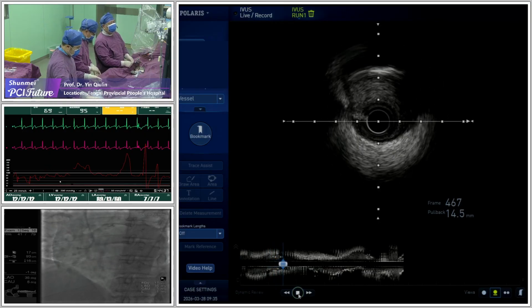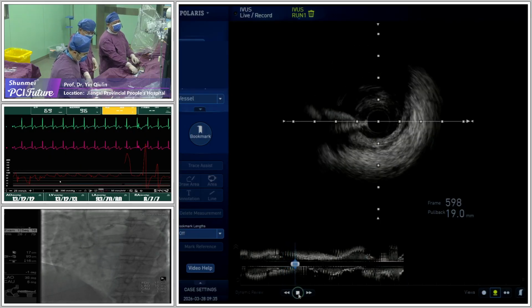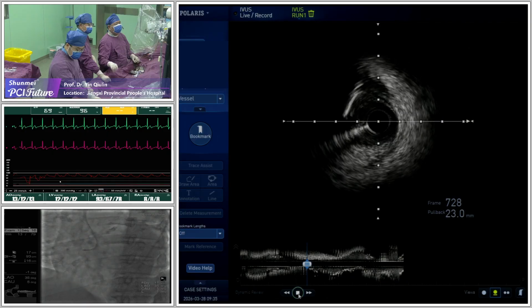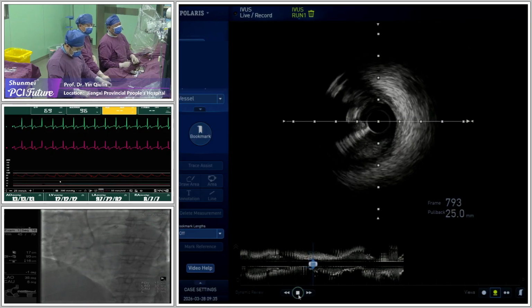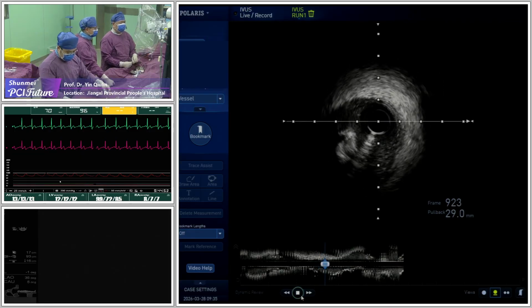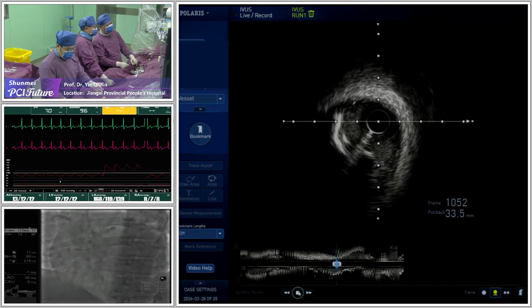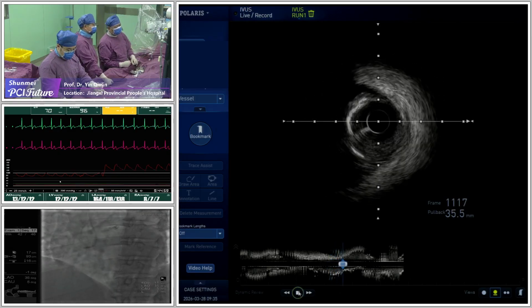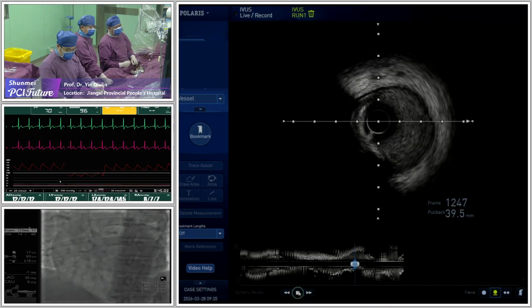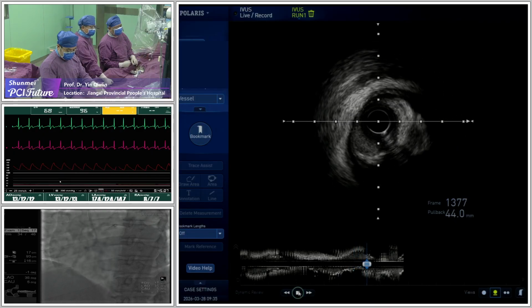But for the sake of demonstration for everyone in the room, we really need to see both the proximal cap and distal cap simultaneously in two views. Then we can decide the strategy, because here it's really difficult to say whether the proximal cap is clear or ambiguous. For sure there is a beautiful retrograde option, but maybe we can start antegrade if the antegrade cap is clear. Yes, I agree with you.